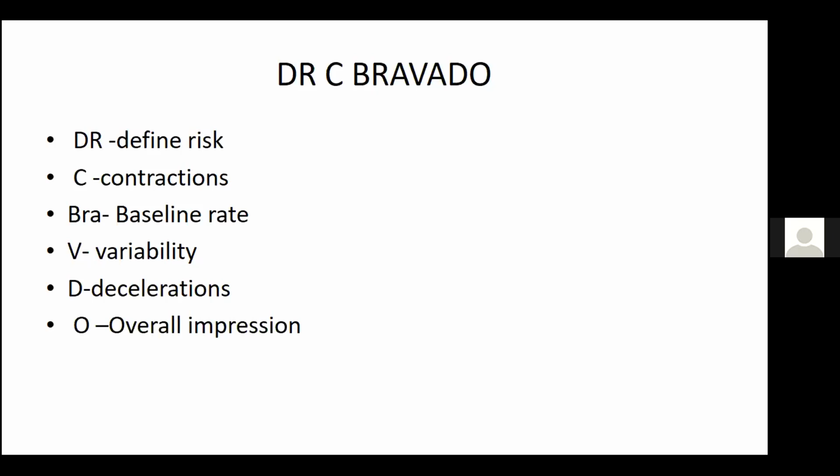Now when you say that to me, it's completely different from when you have a primigravida who is very restless and agitated and shouting and screaming, who has a fetal tachycardia, because that patient may just be dehydrated, having labor for a long time. But the patient where you said the background risk is that she is doing a VBAC, it means that fetal tachycardia in a patient doing a VBAC could mean a rupture or a scar that is dehiscing. So there is no room whatsoever, colleagues, to repeat the CTG. When you start seeing fetal tachycardia in a patient who's doing a VBAC, it means immediate delivery. So that is why it's important to define the risk.